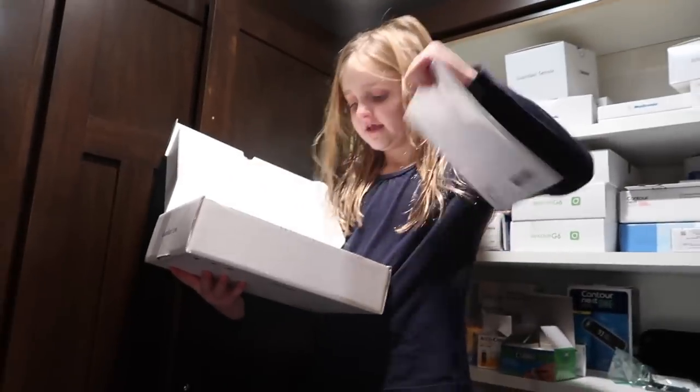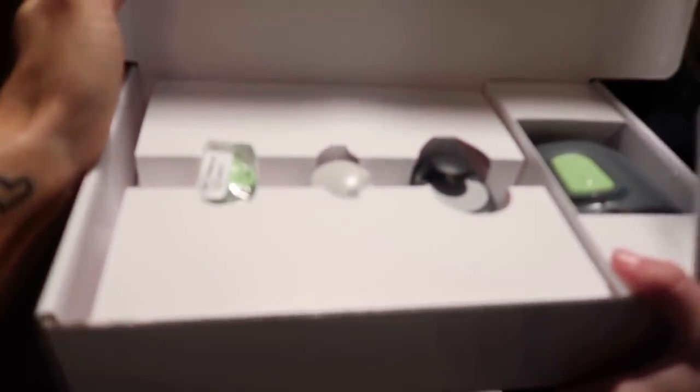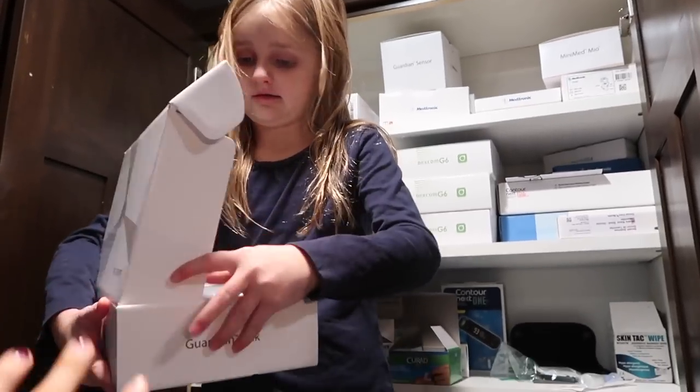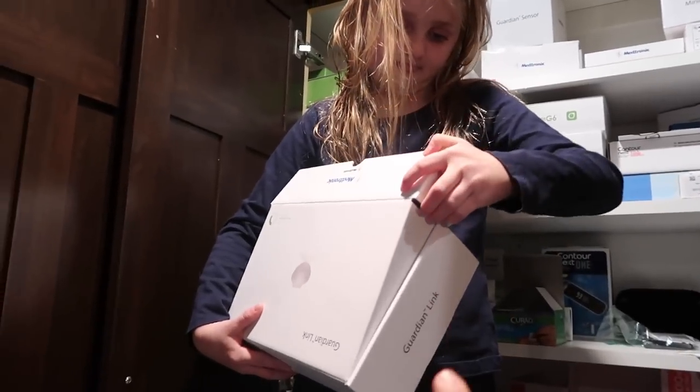You guys used to see that in her videos. And there's a new sensor, a new charger, and a new thingy. We have those because we switched from the Guardian to the Dexcom G6, which you guys know.